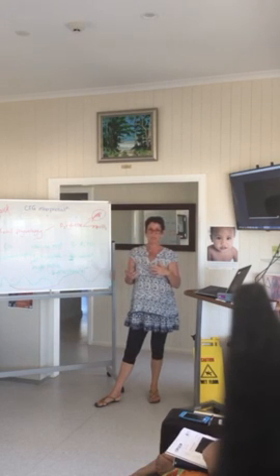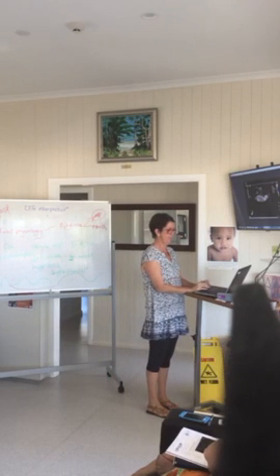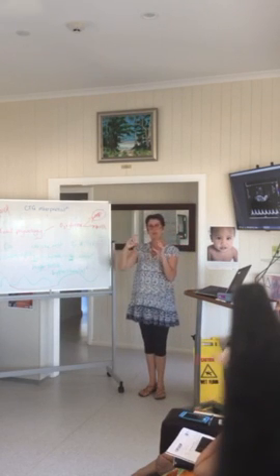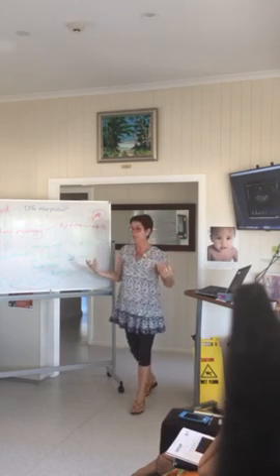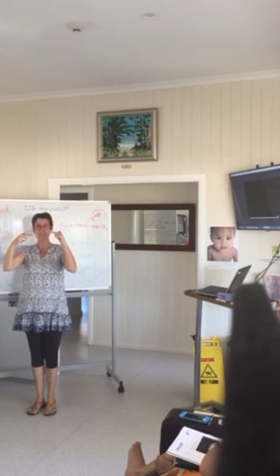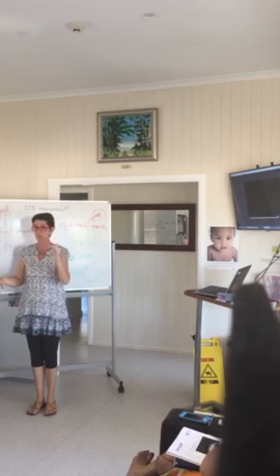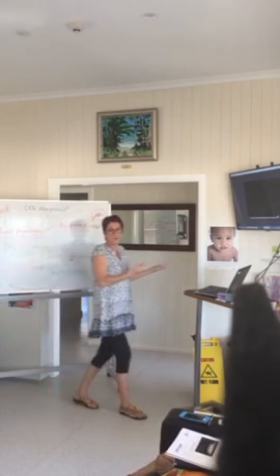I see it in my head like an arterial line has a notch. I imagine that the flow would look like it's got a notch. There's a certain amount of positive flow and then there's a certain amount of negative flow. So they measure in a number what it should be. I can't even tell you what the ranges are, but there's a certain amount that tells you that you've got a good Doppler, and then you can have reverse ones where all you can see is the negative and there's nothing on the positive, so it's telling you there's regurgitation. So that's the extent of my knowledge on Dopplers.